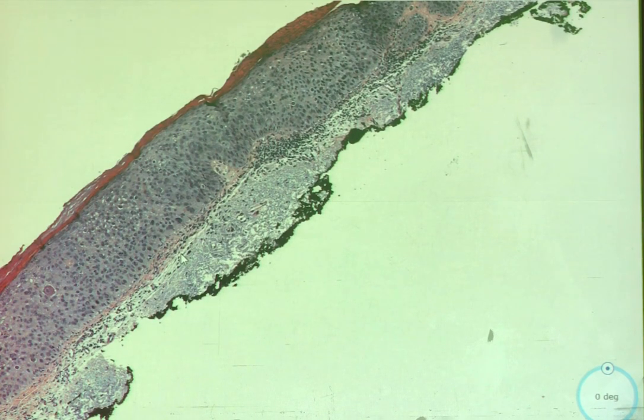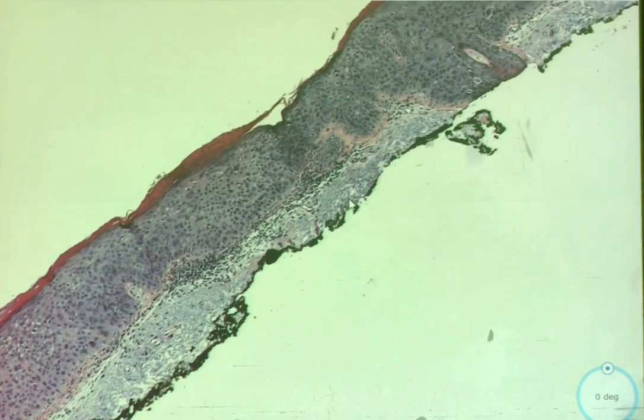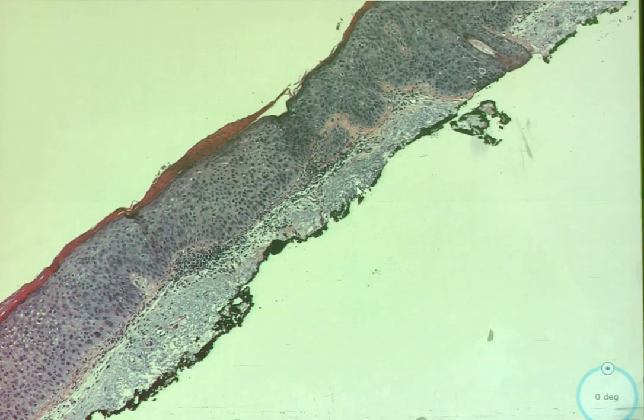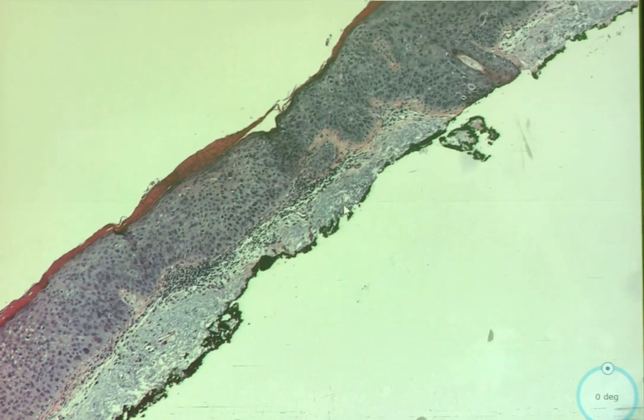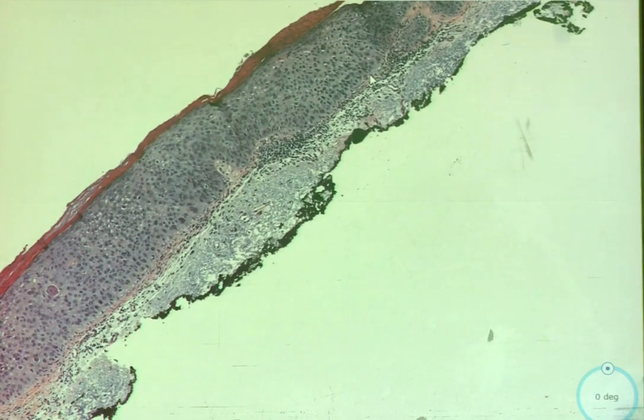Even if it's not at the ink, with so little dermal tissue, you would want to put a note, just in case there's something hidden on a deeper level. For the most part, though, they're not going to leave this without going back, we hope. This would probably get a Mohs if it's on the face or something.